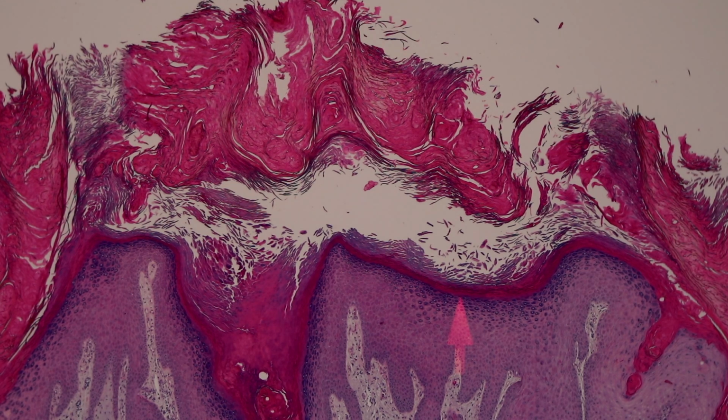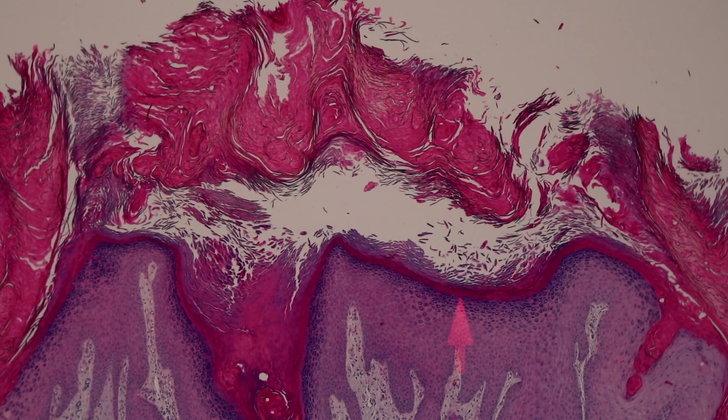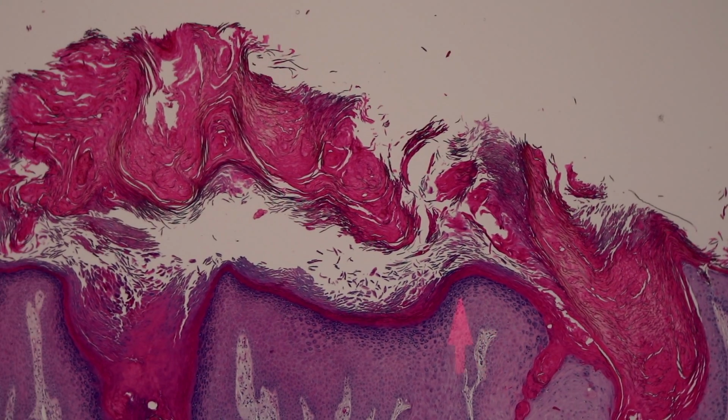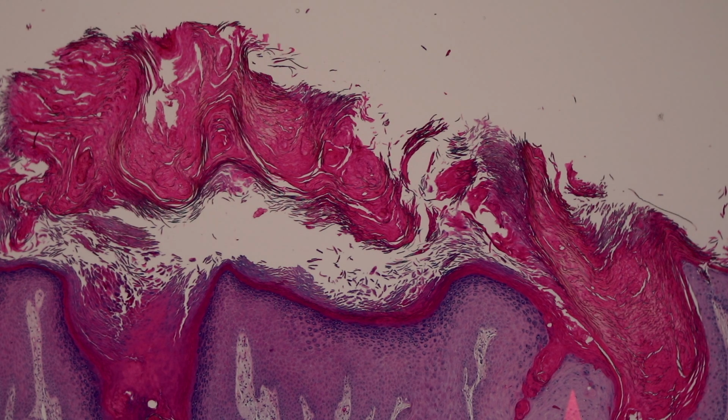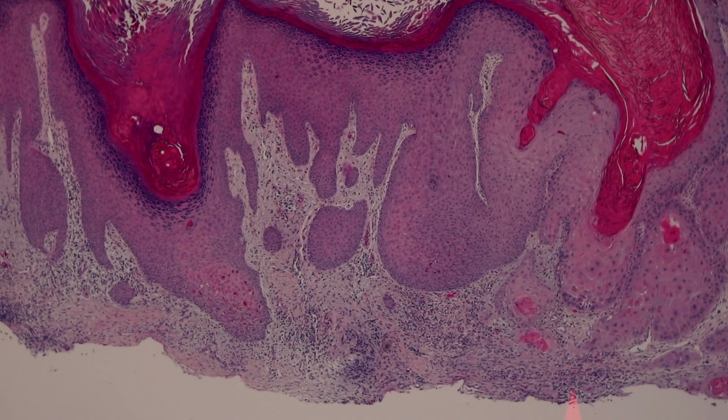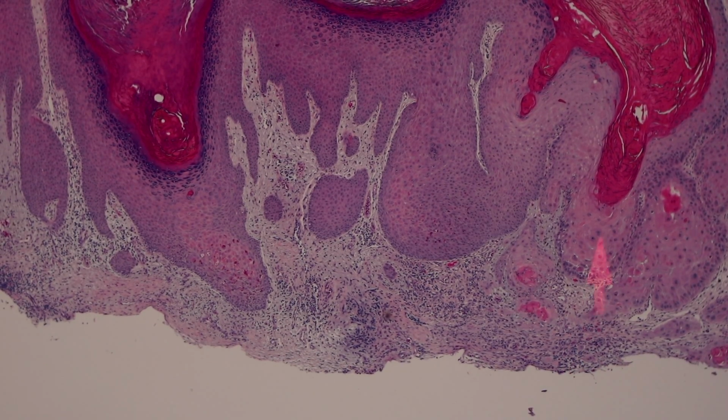If you see this kind of change and there's any atypia and it's transected, I tend to be a little cautious. Like, what if I had this? It's pushing down a little. It's got a bunch of keratin production. It's got a little bit of glassy, expanded pink cytoplasm, but I don't see anything that looks like obvious squame there. It really doesn't even look quite right for actinic keratosis, but look what happens when we go deeper. It's clearly an invasive squamous cell carcinoma right here.